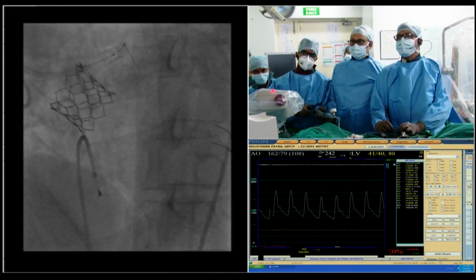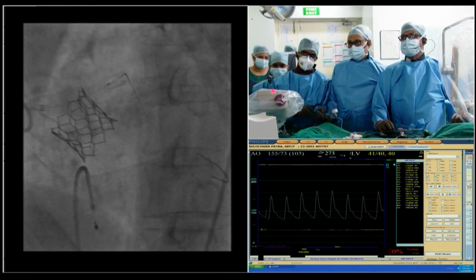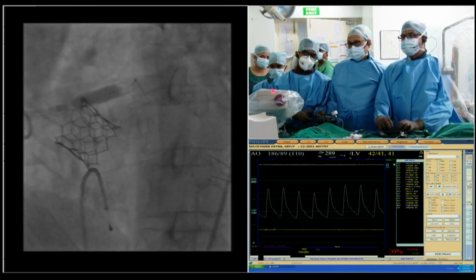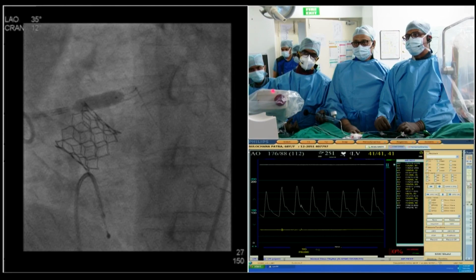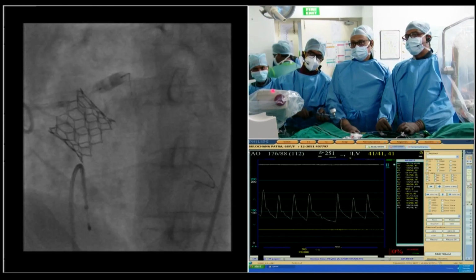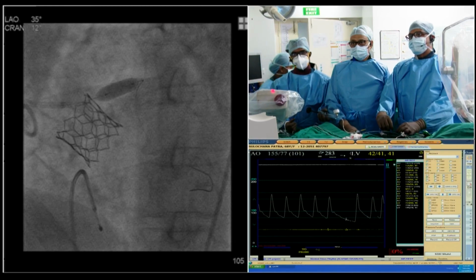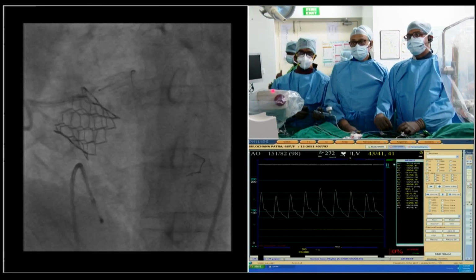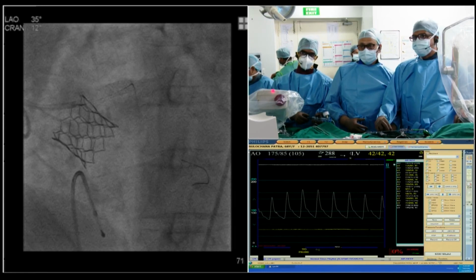Okay. Now. One minute, hold on. Okay. Go ahead, inflate. Okay, that's good. Down. We didn't do the overlap. Okay, go ahead and inflate. Inflate 12 again. We're just doing the overlap. And okay, down. Okay. Ready to see? Yeah.